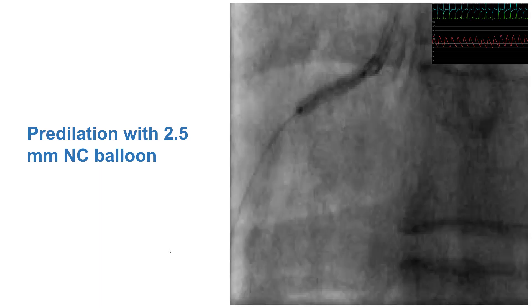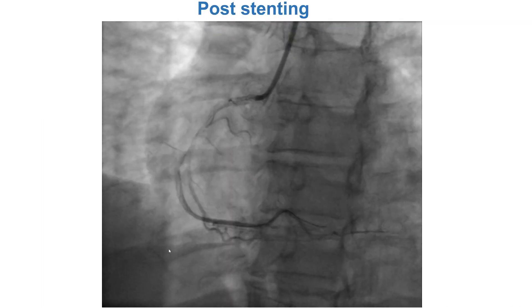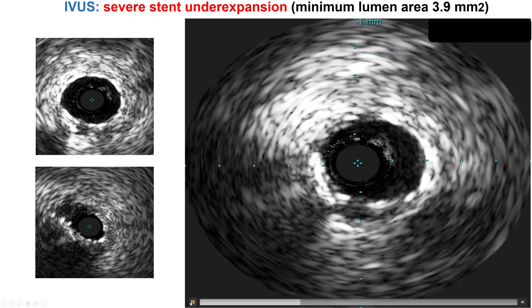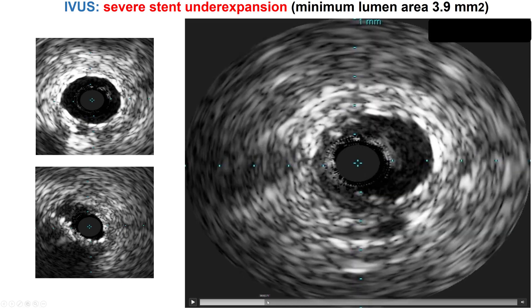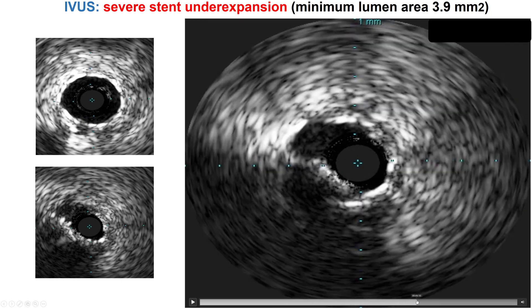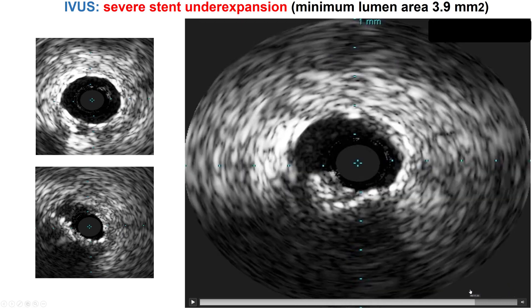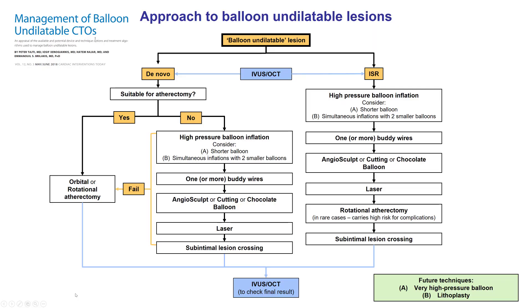The lesion was predilated with a 2.5 mm NC balloon. It seemed to expand well, and therefore we placed a 2.75 by 20 mm drug-eluting stent, which appeared to be okay on angiogram after the stent was deployed. We routinely do intravascular ultrasound after we place stents in the ostium, mainly to confirm the stent goes all the way to the ostium. Here we saw that the stent was well expanded in this segment, but when we went close to the ostium, the stent was significantly underexpanded — an area of underexpansion not appreciable by coronary angiography alone.